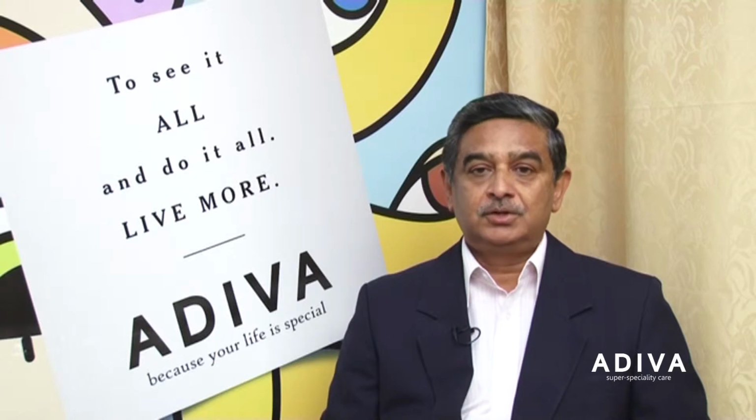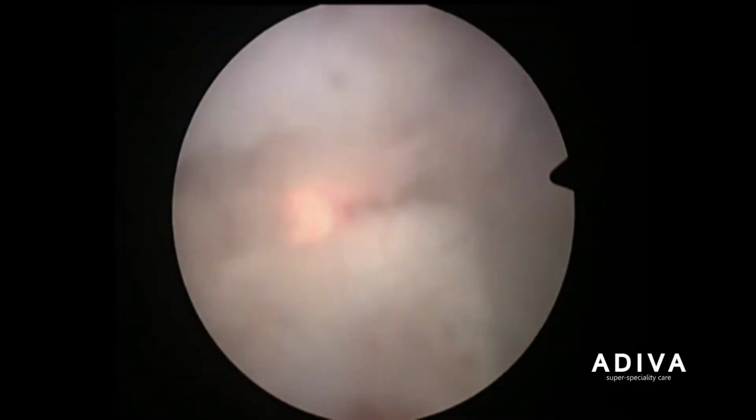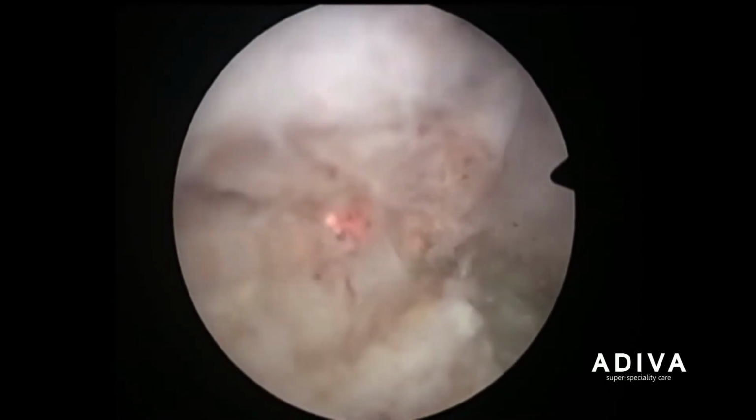During the clip, I am going to show you today what is laser enucleation of the prostate gland and what is a transurethral resection of the prostate gland. These are two technical terms, but I think it's extremely important to know what is the difference between these two procedures. Now the procedure you are watching is a Holmium laser enucleation of the prostate.